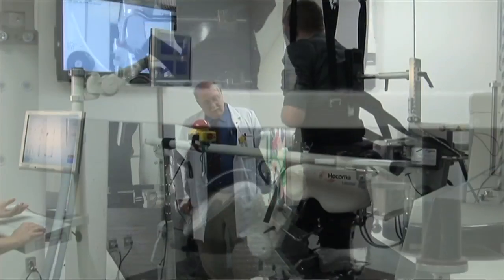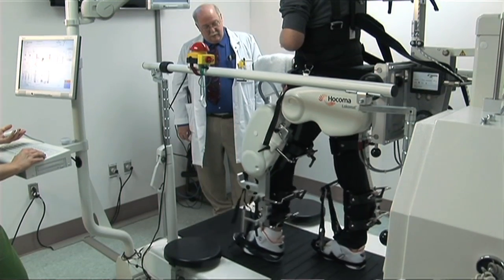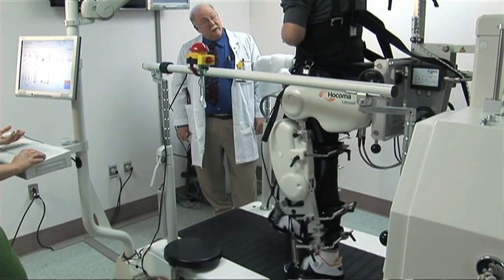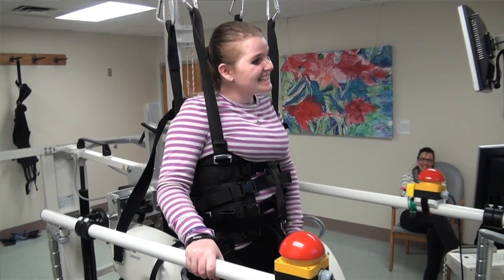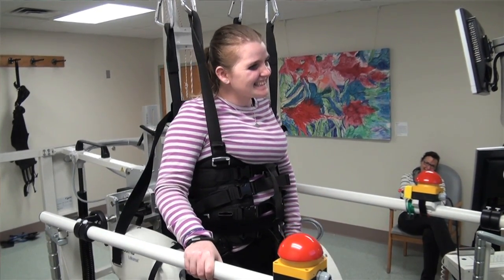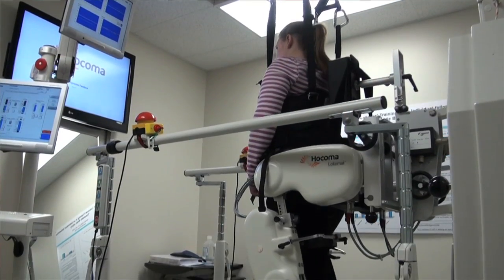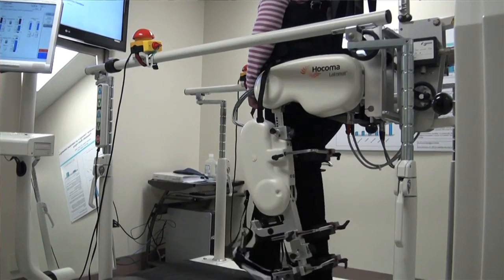As a therapist gets tired, you start to slump over to the side and your hips might drop behind you. The machine doesn't get tired, so you get to practice the same thing repeatedly — building a pattern in your brain so you don't have to think so hard to get that leg forward. It doesn't matter that you're a little scared; it's holding you up and you feel steady taking that normal step again.